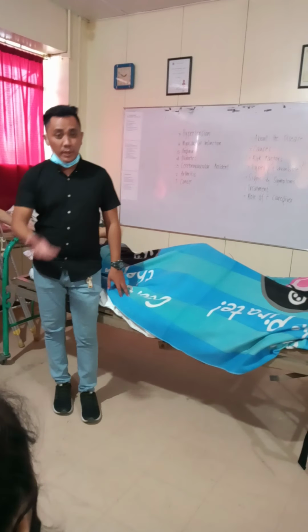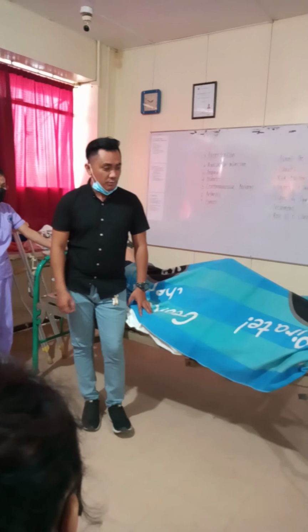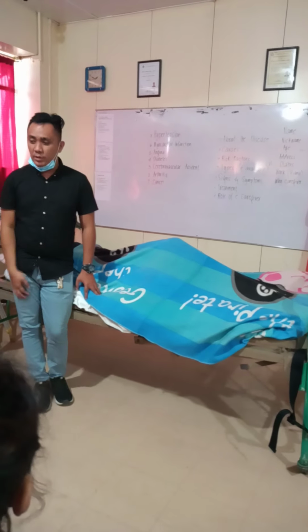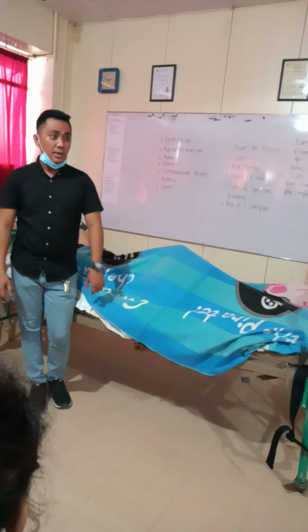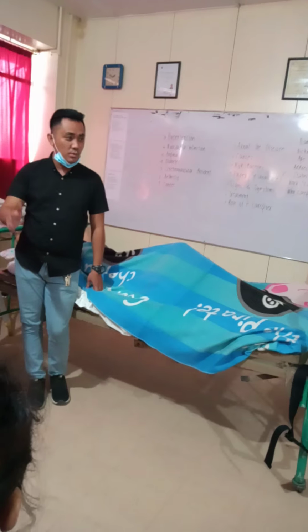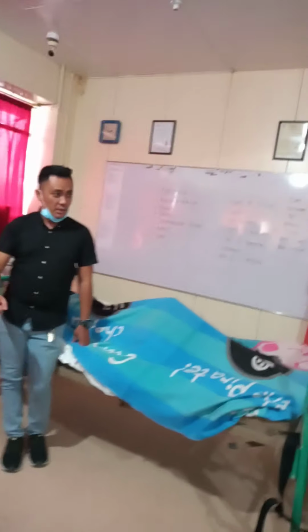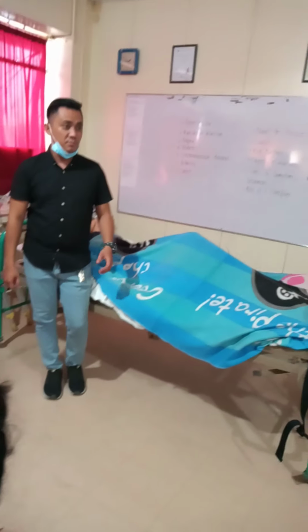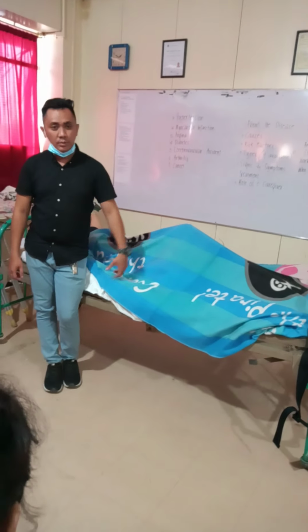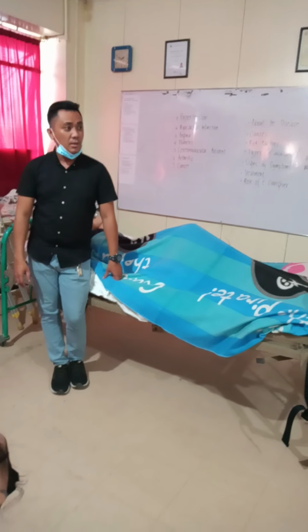From bed to wheelchair, then back from the wheelchair to the bed. Now, for these procedures, this is one of the common procedures, especially if you will be working in the hospital or in elderly homes. You will perform it almost every day, every 4 hours, 8 hours. Especially transferring the patient from the room, going to the hallway, going to the activity room or dining area.